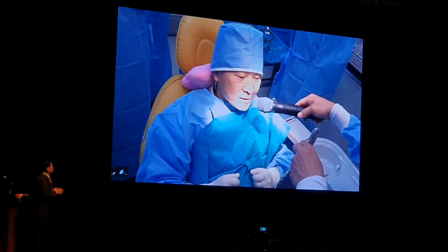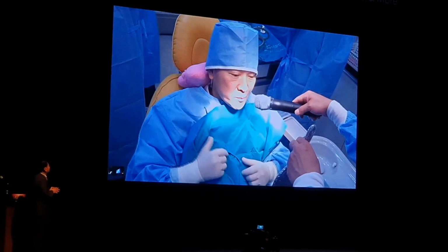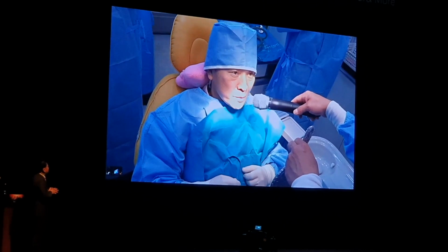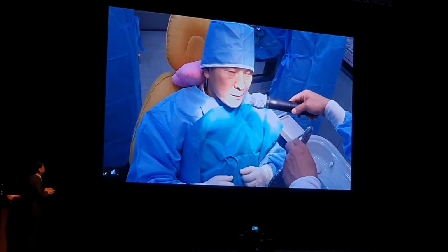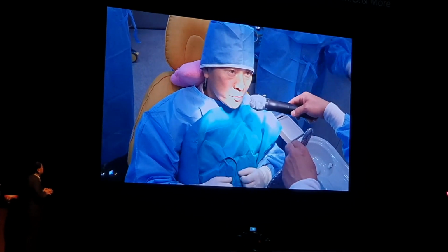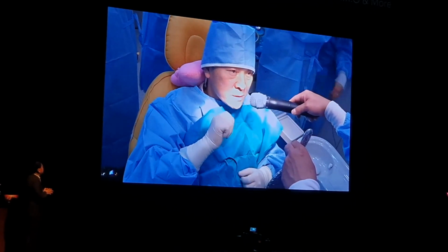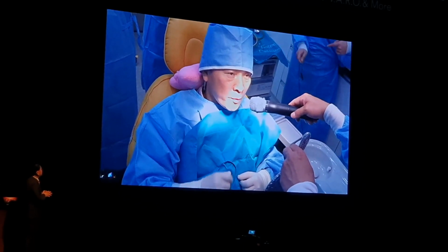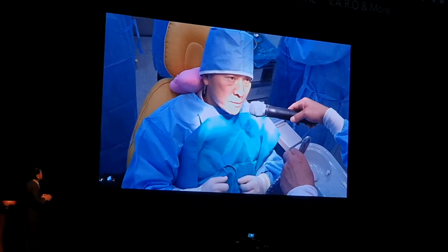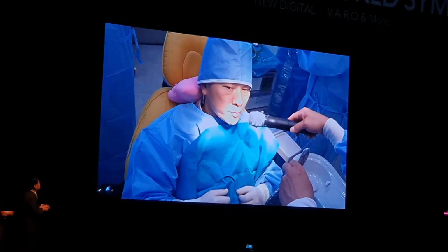So we are almost ready here. I can't think of anything that could go wrong, and Dr. Kim is right beside me. So if anything does go wrong, he's here to help. I only do the procedure that uses the guide, and hopefully Dr. Kim will take over for the rest, like bone grafting and others.